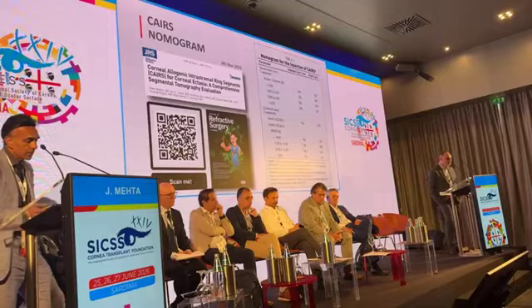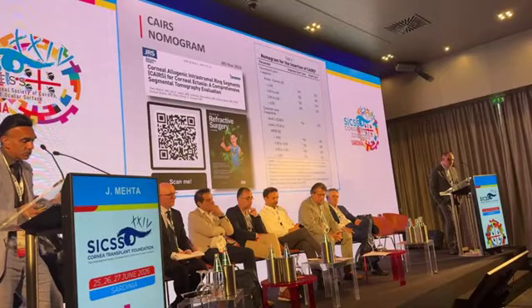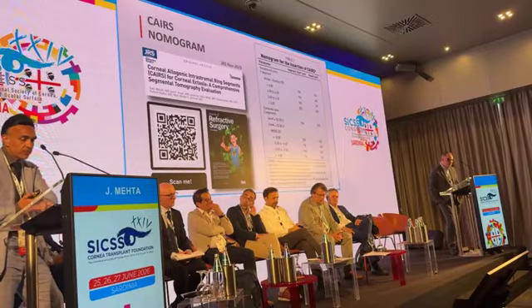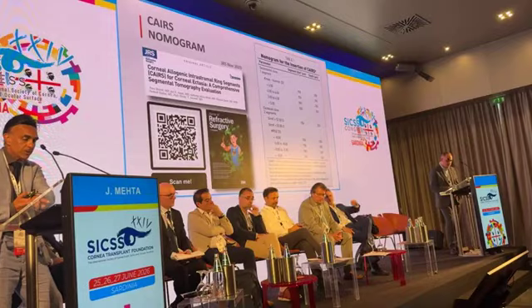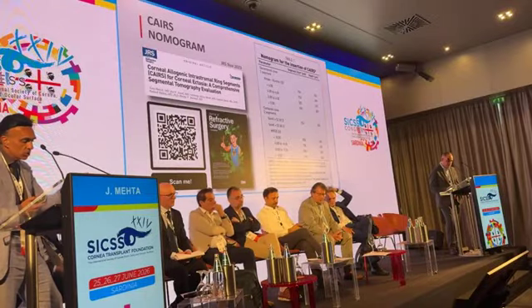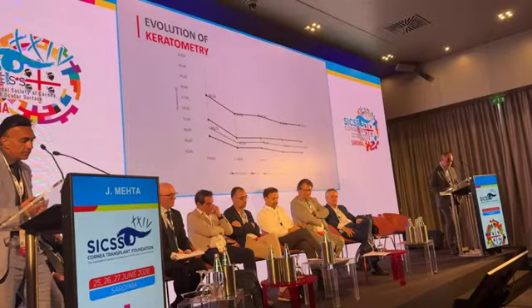So this is from Shadi's publication looking at evaluation of tomography outcomes. Generally most of the segment sizes are 750 or 500, and when you go through a depth, you can see from here from 250 up to 300 in the centration. You can move it with a laser system after the docking. You can see 81% improvement in corrected visual acuity, and 2 lines improvement as well. Likewise in unaided distance visual acuity, but the idea is to regularize the corneal surface.